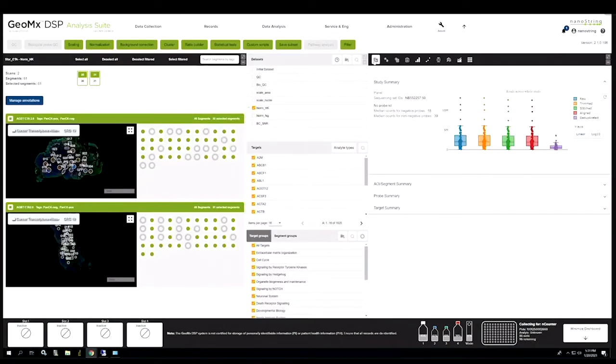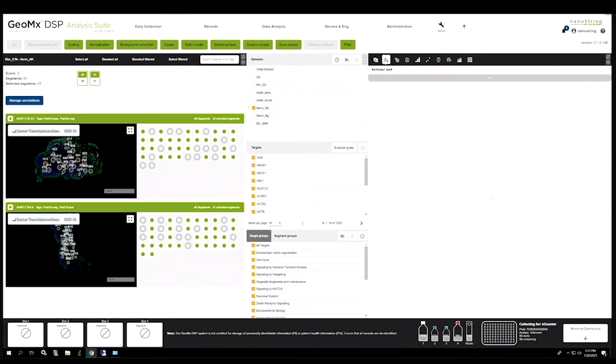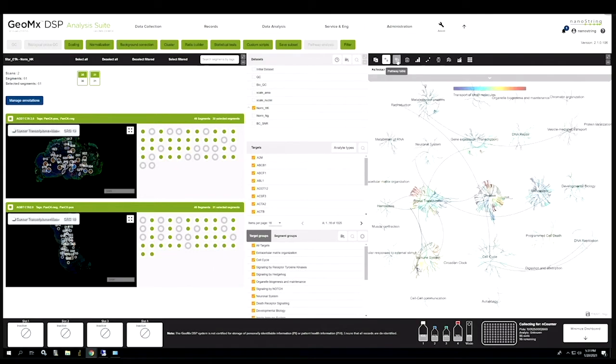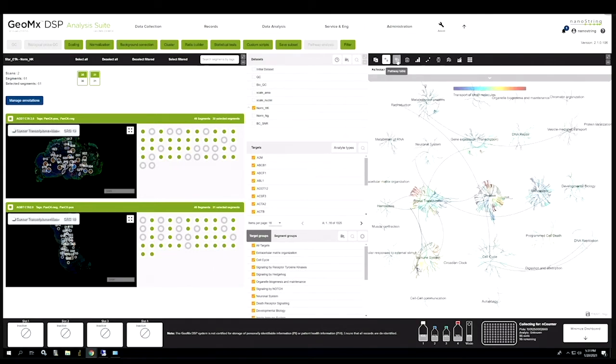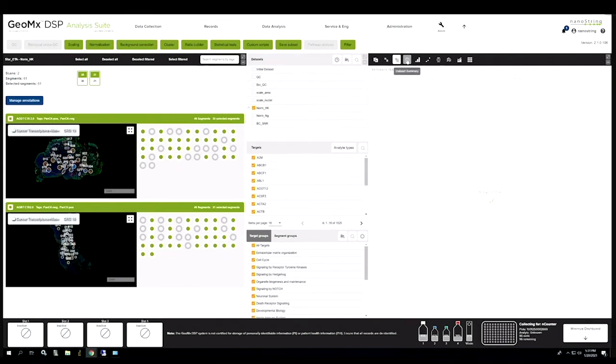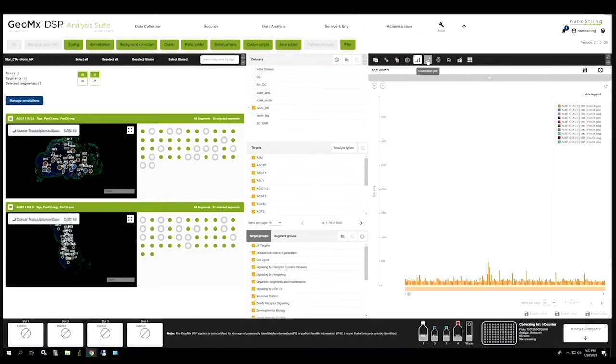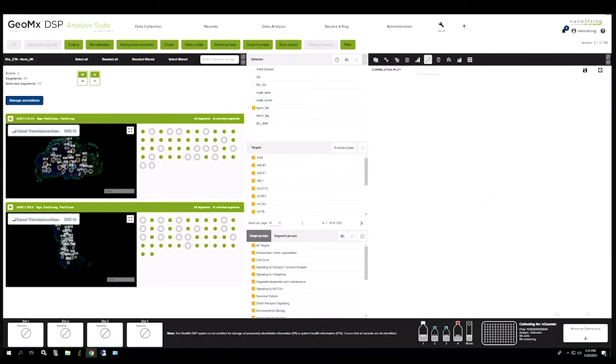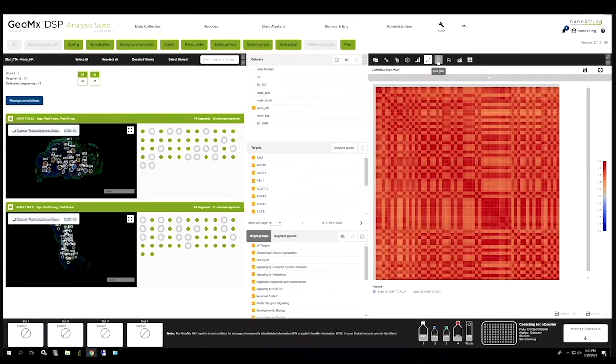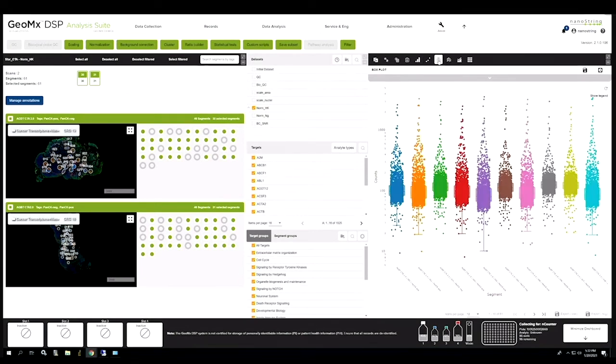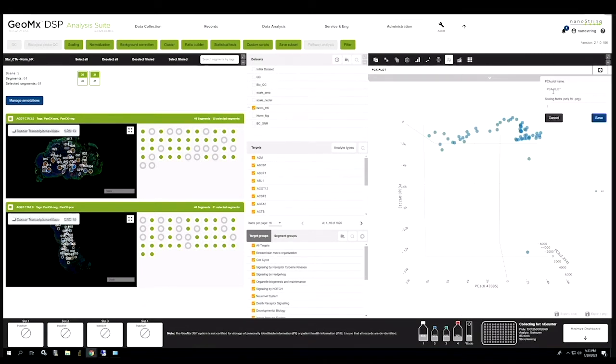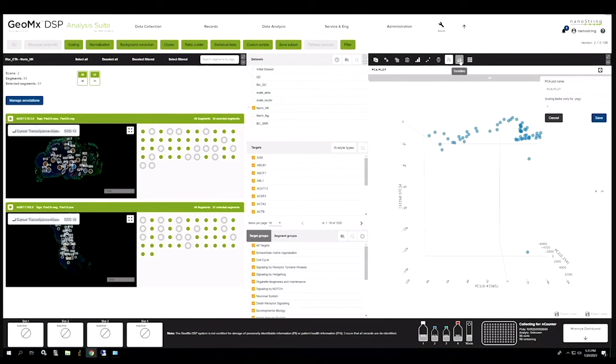Once you normalize the data you can see in your visualizations pane different graphs, including pathway maps, pathway tables, bar graphs, correlation plots, box plots, PCA plots, trend lines, and we can view heat maps.